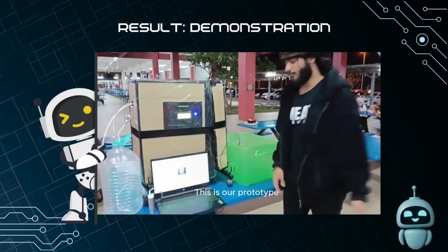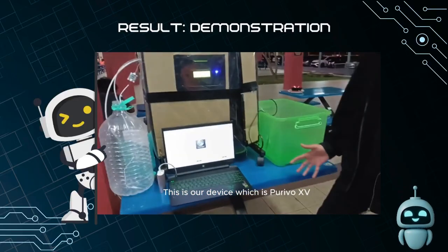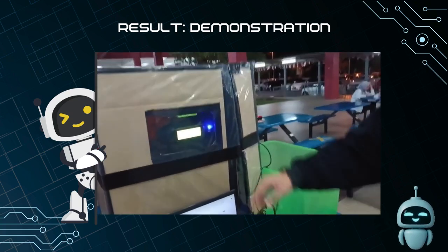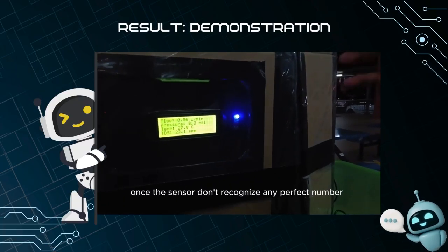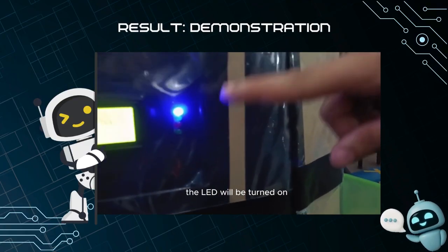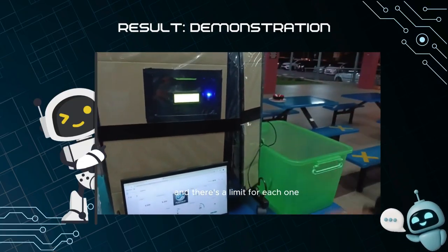This is our prototype for the smart monitoring system for units. This is our device, which is Purivo XV. Our device is here to measure four things: the flow, pressure, temperature, and conductivity. Each one has a different LED with a different color. Once the sensor doesn't recognize a proper number, the LED will be turned on, which means that something went wrong, and there's a limit for each one.